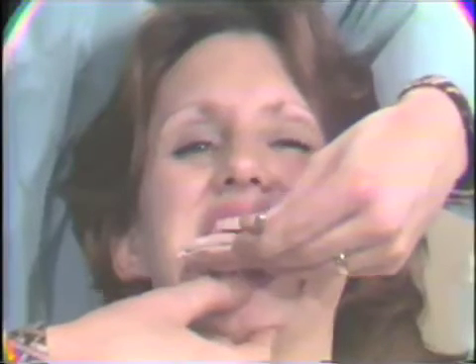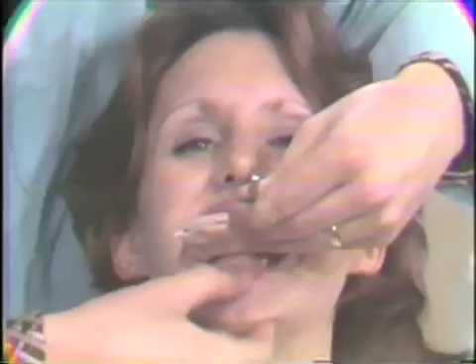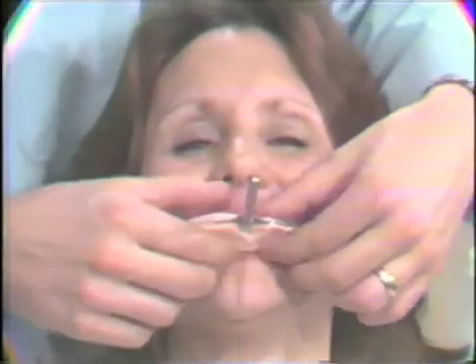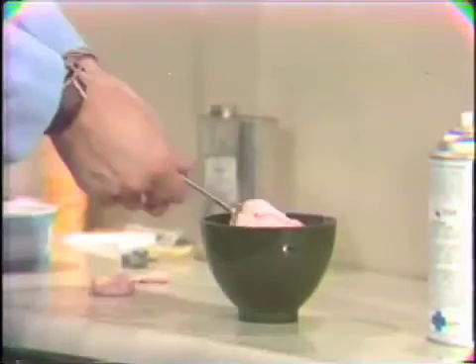Okay, open and close, please. Also, we'll want to make sure that we're not locking it into any other undercuts. Okay, hold it right there, please. Now, you have to feel this, and as it starts to get warm, we're ready to take it out of the patient's mouth and place it in some water. Once it is set up in the water, we'll be ready to take it into the lab and trim off our excesses, and we'll be ready to start our stereographic recordings.